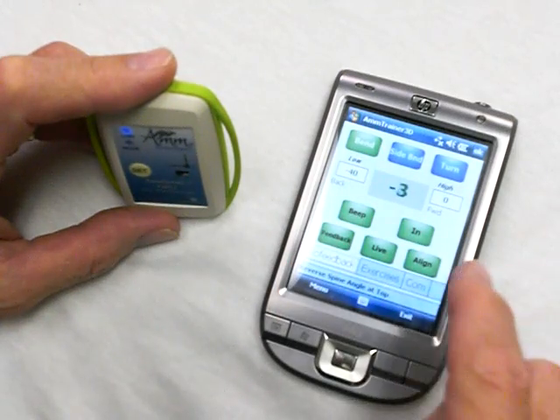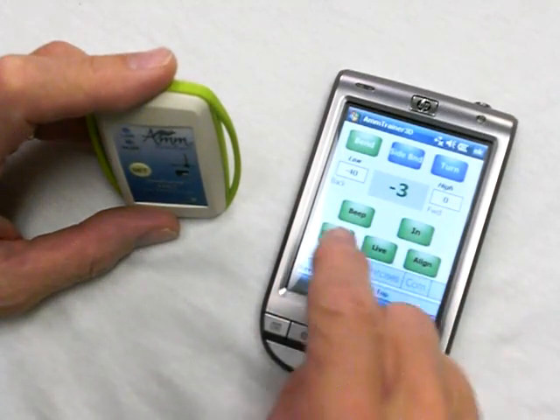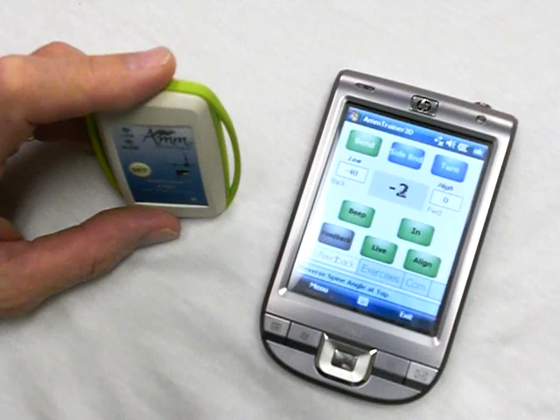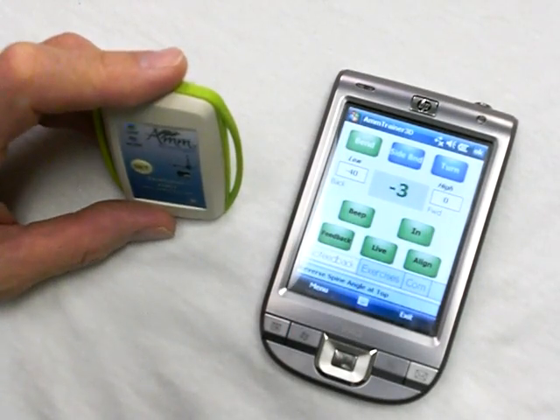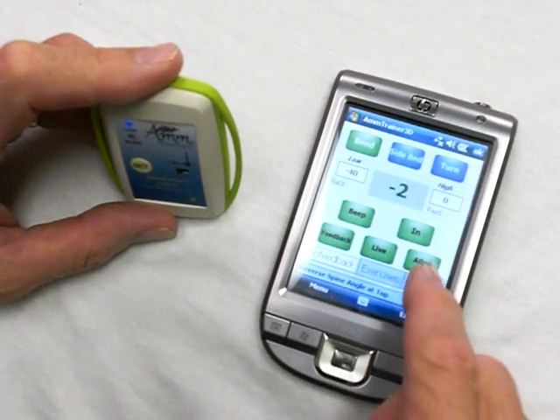Go into biofeedback mode. You can turn it off and turn it back on. If I need to align it, I can do what's called snap align.